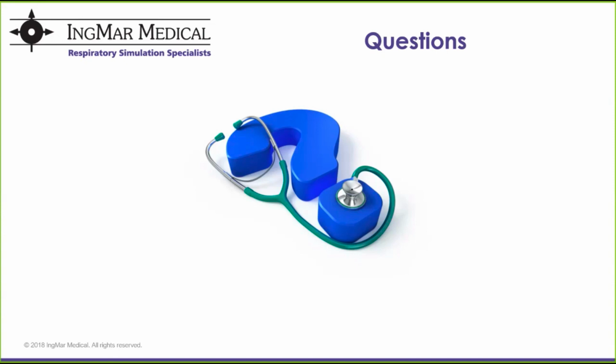A question here from Tom. Will live gases from an anesthesia machine cause damage to the ASL? That is a good question. The answer to that is yes, potentially. You are, as the user, required to use only compressed air to run the system, which means 100% oxygen is also causing a potential harm to the internal components of the SimMan mannequin. Similarly, these anesthetic agents would not be able to be introduced to the internal components of the ASL. So that would be a limitation there.